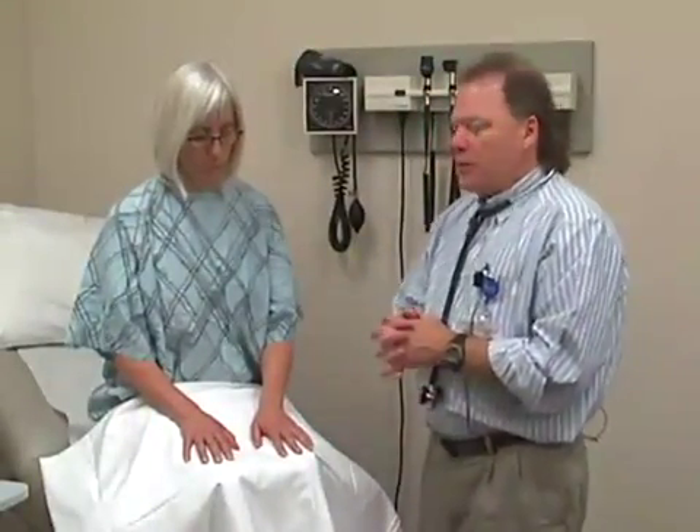I'm also observing her breathing to see if she may be in distress. After making this general assessment, we move on to vital signs. The first vital sign is weight and the second is height, which are used to determine body mass index or BMI. That will have been done prior to Mary arriving for the exam today.